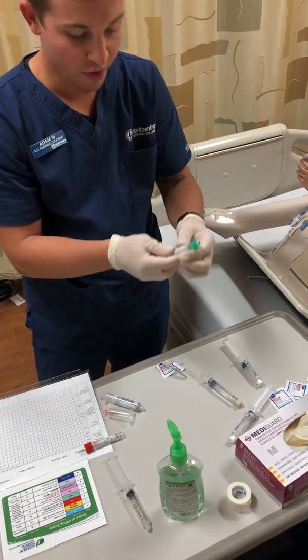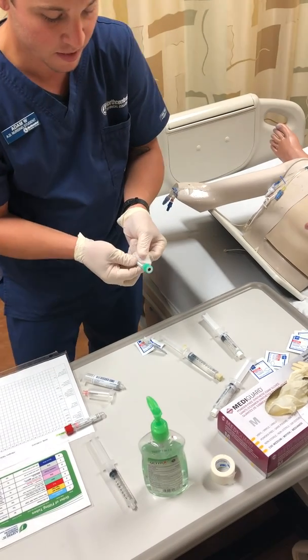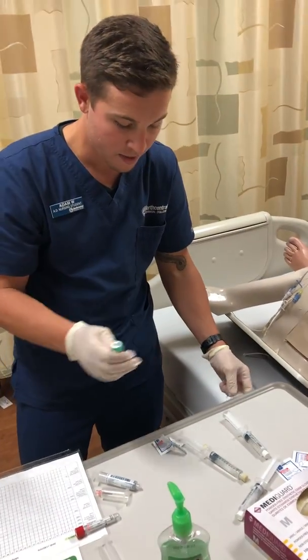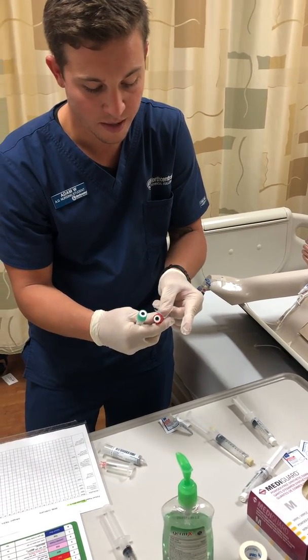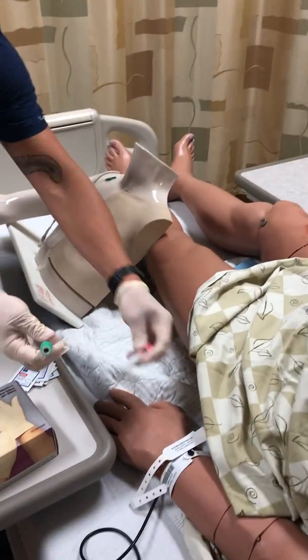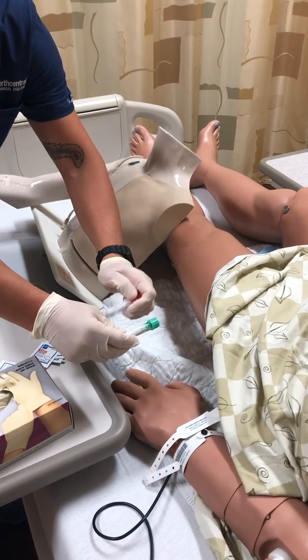So here we're going to want to label. We're going to add initials, date and time, making sure that we don't cover up our label of what we had just collected and what it's for. Okay, so after getting our labels on, we're going to compare with our patient to make sure that we have the name and date of birth, and it matches up. Name and date of birth match up.